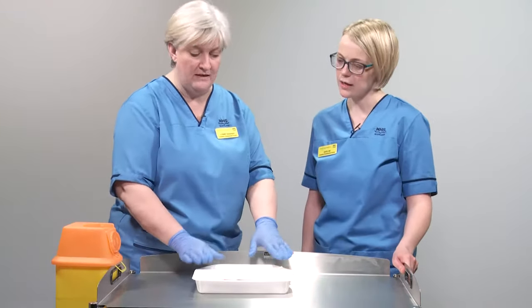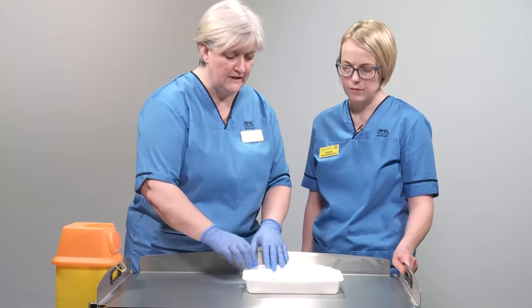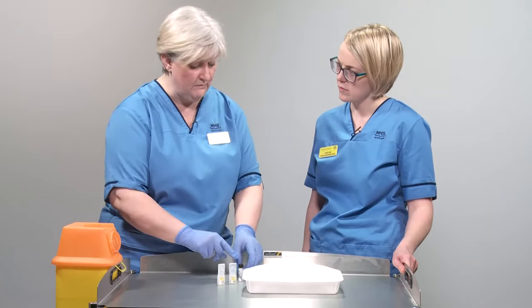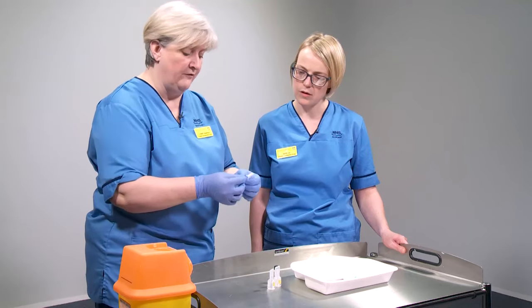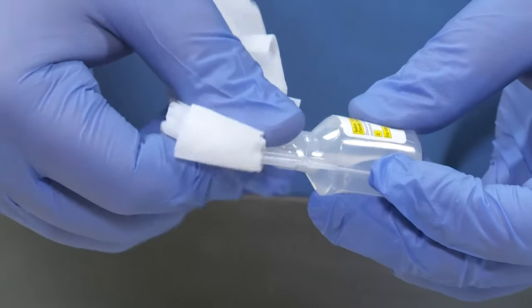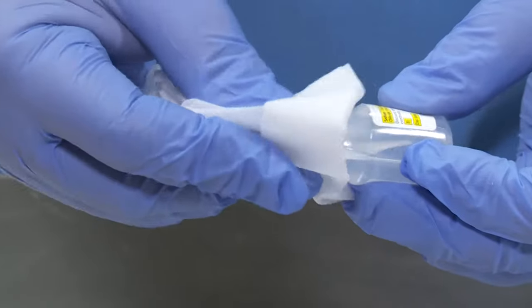Now we've got a clean tray with all the equipment gathered. The first thing I'm going to do is get our Clinell wipe and clean off the tops of the vials — my flush, my diluent and my medicine. These cloths are big enough to get a clean part and just clean the neck. All of these get cleaned for about 15 to 30 seconds. The Clinell wipe kills off more bacteria, so it gives a better disinfection than just a regular alcohol wipe.